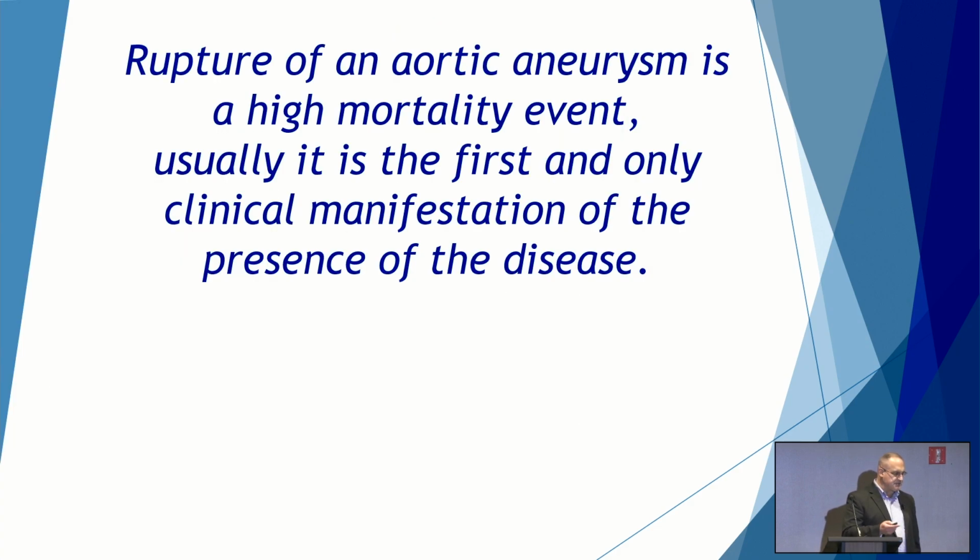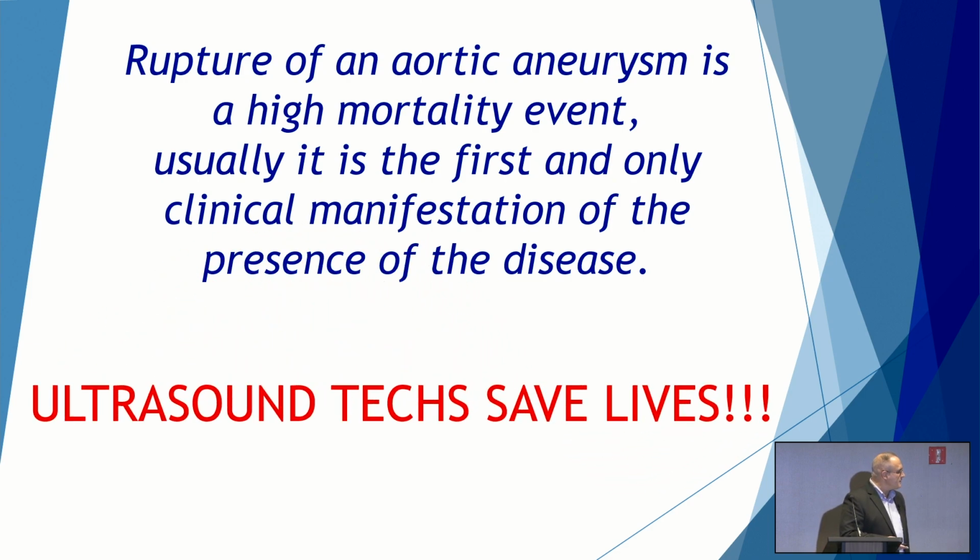This leads me again to my first point. The rupture of an aneurysm is a high mortality event, and it can be the first and only clinical manifestation of the presence of the disease. Therefore, ultrasound techs save lives with screening and surveillance. So you play a huge role in the treatment of this disease.